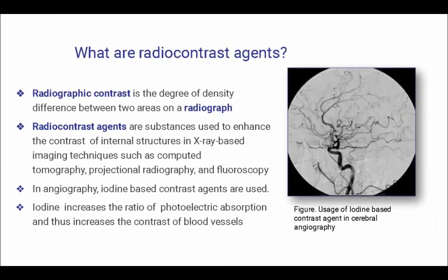After we insert a catheter, we must inject a radiocontrast agent. But let's first clarify what radiocontrast agents are. Radiocontrast agents are substances which are used to enhance the contrast of internal structures in X-ray-based imaging techniques, such as computer tomography, projectional radiography, and fluoroscopy.